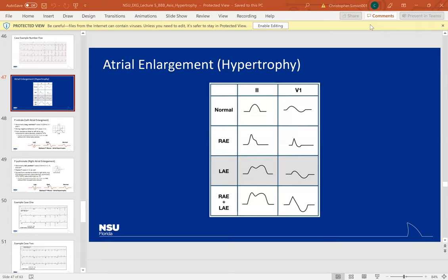We're back and we're going to be doing some hypertrophy stuff today. We're going to be looking at hypertrophy of the different chambers of the heart — your atriums on both sides as well as your ventricles on both sides. Let's talk about what hypertrophy really means.